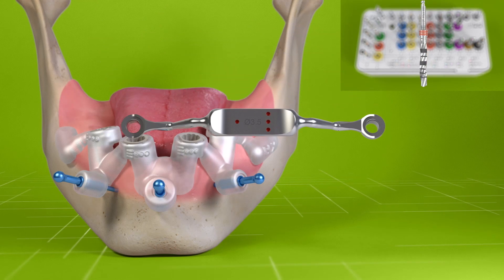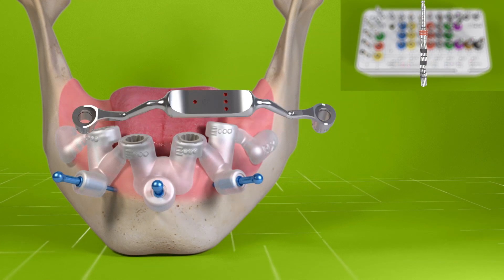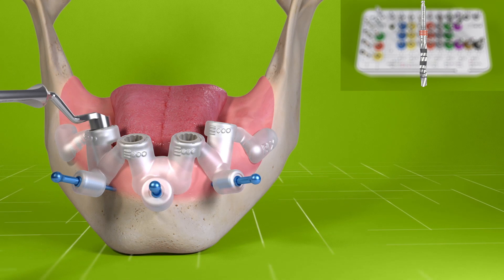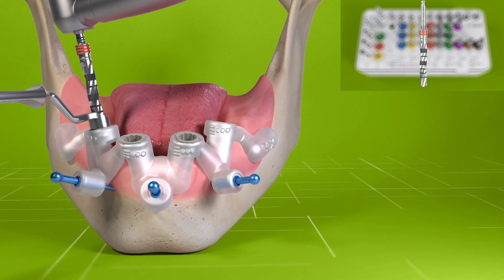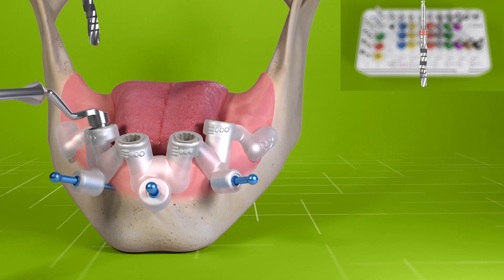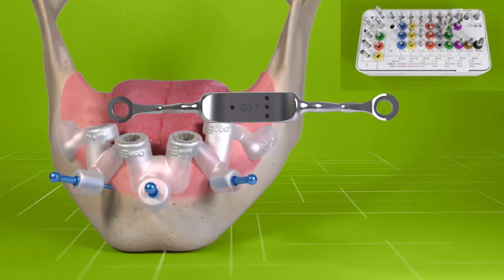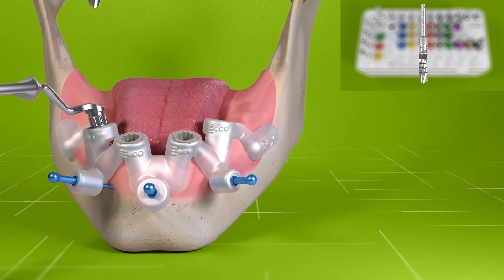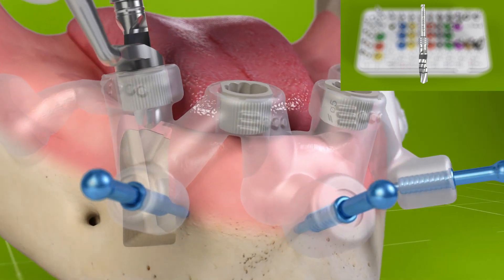According to the BLX protocol in hard bone, proceed with the 3.5 millimetre velo drill to full depth. Then use the 3.7 millimetre velo drill for coronal widening, drilling the top 4 to 6 millimetres of the implant bed.